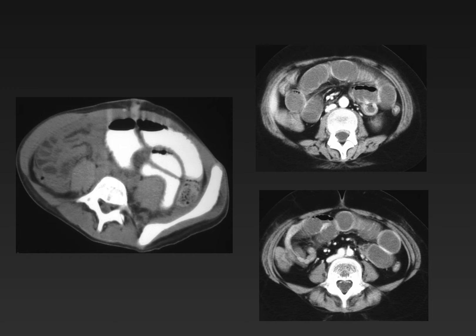Here are two children with acute small bowel obstruction following recent surgery. The image on the left shows dilated proximal small bowel and absence of oral contrast in more distal bowel. The images on the right from a different child show an acute caliber change in the right lower quadrant, and obstruction is the result of adhesions in both of these children.